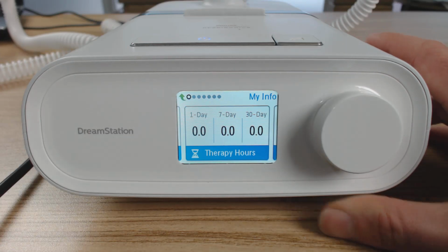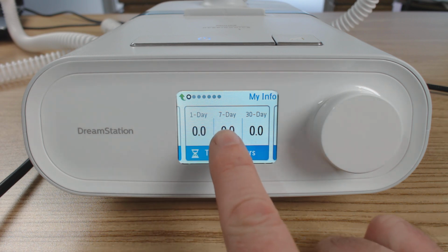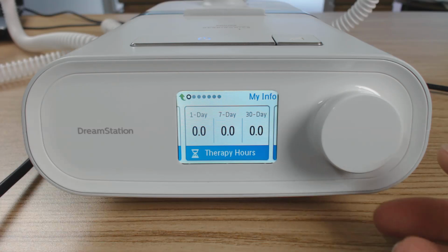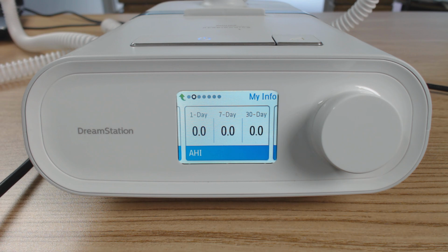Now at the start here with My Info, the first thing we have is the therapy hours, and it breaks it down into 1 day, 7 day, and 30 day. If we're looking at the 1 day, that's last night. That's how many hours you actually had of therapy. So if it's 7.5, you've got basically 7.5 hours of therapy. 7 day is an average over the last 7 days, and 30 day is an average over the last 30 days. Pretty self-explanatory.